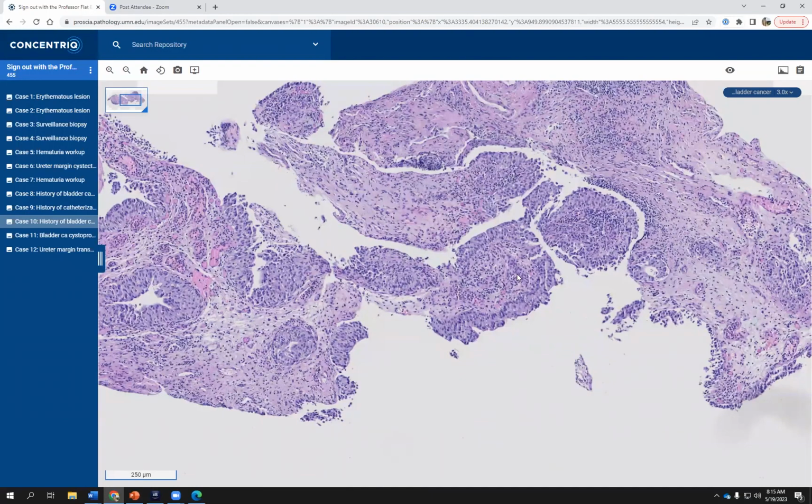My recommendation is I would never use the term dysplasia at all. Why? Because we just don't have the ability to discriminate confidently between reactive atypia and true neoplastic atypia. Whenever we use the term dysplasia, we are committing to a diagnosis of neoplastic transformation.